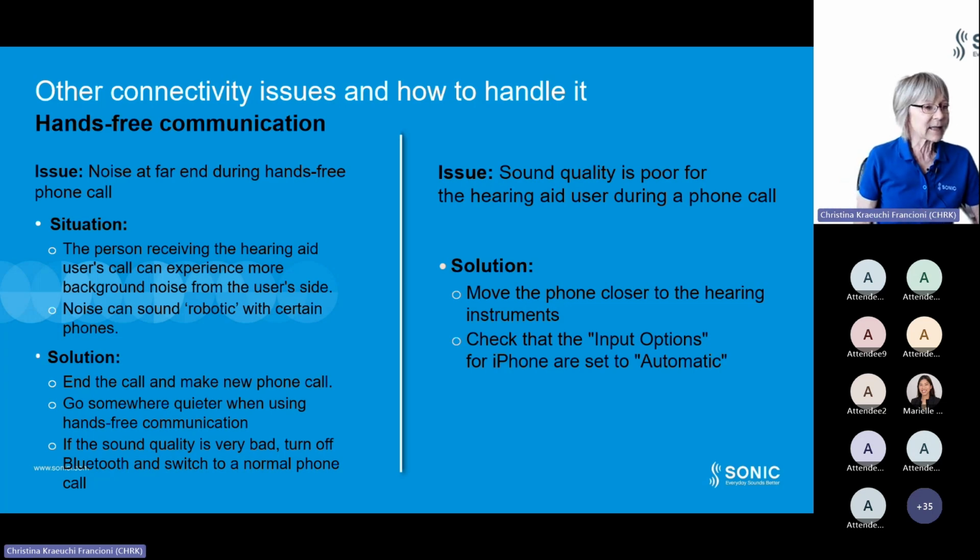The solution is that the hearing aid user should end the call and make a new phone call, and then maybe go to an area which is a bit quieter when using hands-free communication. If the sound quality is very bad, then the hearing aid user should turn off Bluetooth and just switch to a normal phone call.